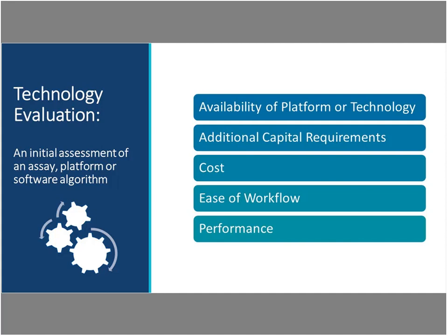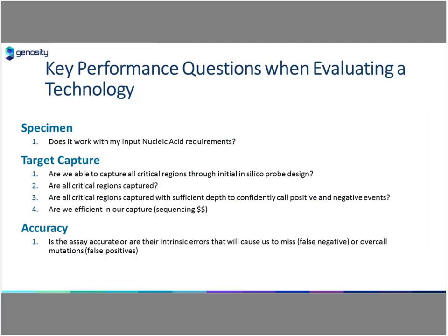So ironically today, even though we're many years into next generation sequencing being common practice in laboratories, workflows have still not matured to the point of being completely turnkey, so there's opportunities there. They continue to get easier, but this is a key consideration. And then lastly, the performance itself. How well does the assay perform?